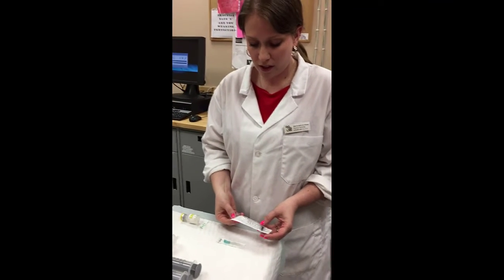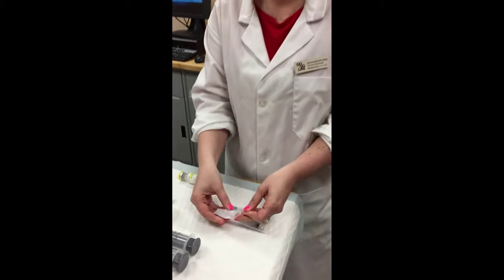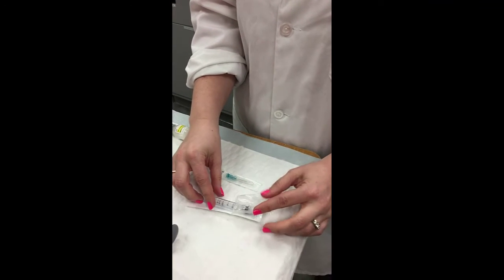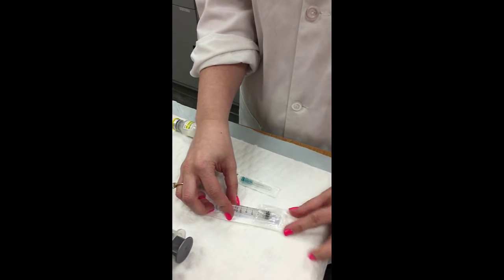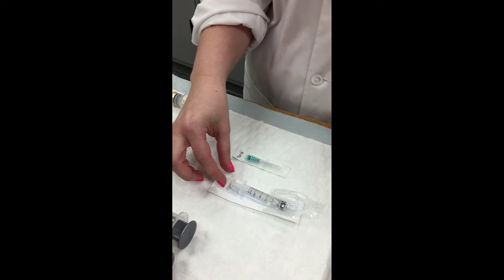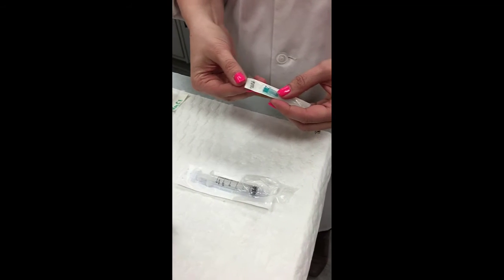So what you're going to do is you will open up your syringe package. Note that I've kept the sterile end of the syringe still in the package until I'm ready to use it. I can touch this end of it, so the working end stays sterile.